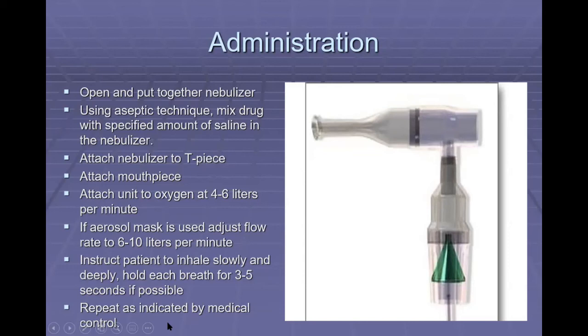If an aerosol mask is used, so let's just say we have a mask that we're going to be using instead of just a mouthpiece, it needs to be turned up to about 10 liters, so that it will really start to blow and make a good aerosolization.